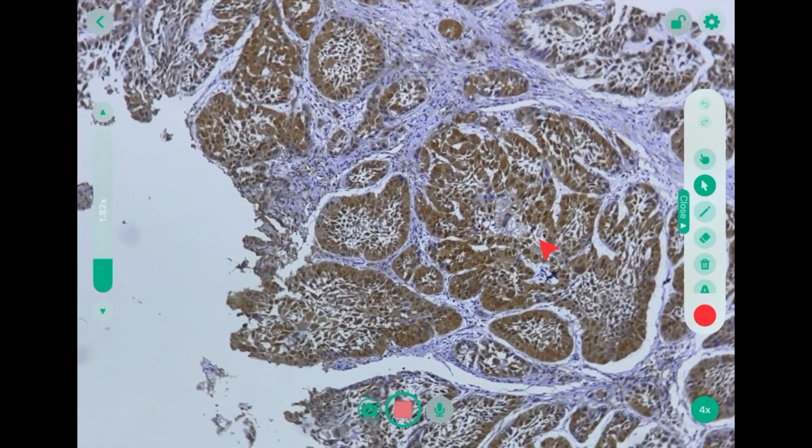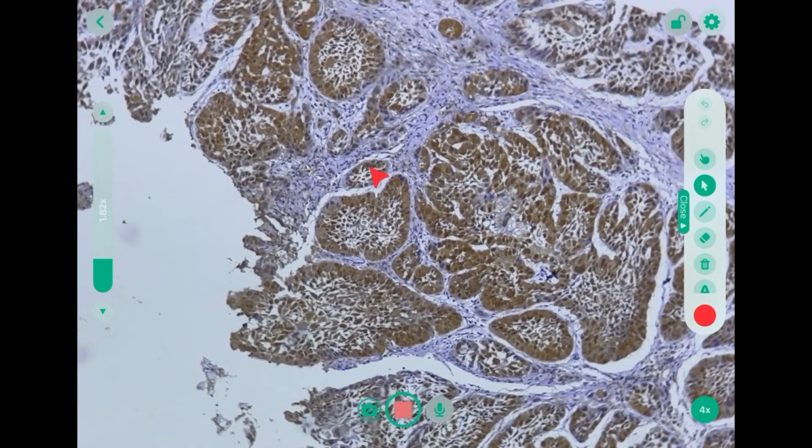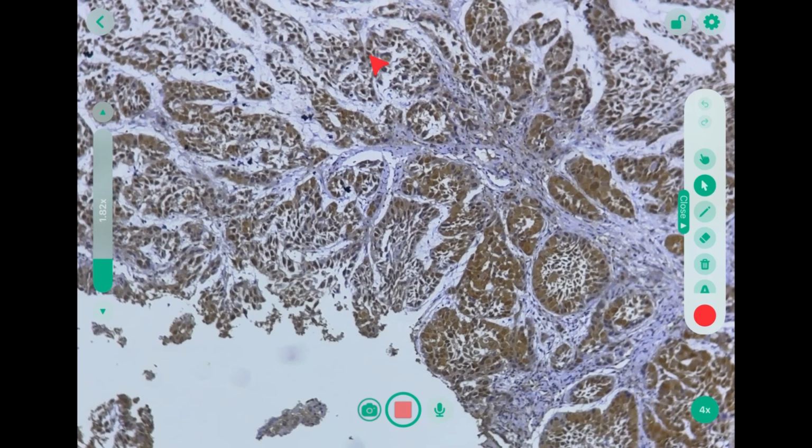Here we can appreciate another feature which is more prominent in this immunostain, that is some amount of peripheral palisading is present. In case of HPV associated or P16 positive squamous cell carcinoma, generally a basaloid pattern is present. Although basaloid pattern is a little bit toward poorly differentiated, here we can appreciate many nests, so at least moderate differentiation is there.